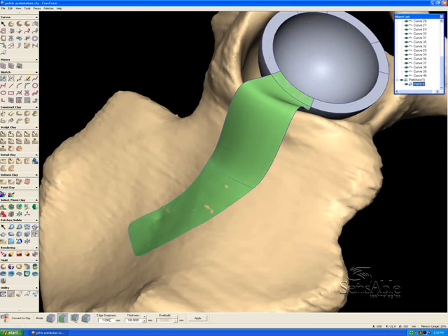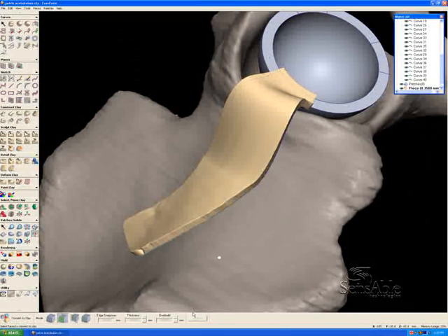And then I'm going to go down here and select an edge sharpness of 0.35 millimeters and a thickness of 5 millimeters. I don't know, actually let's make that 4 millimeters, and then we'll say OK. We'll apply that, and what that's going to do is create a thickened representation of this surface in virtual clay that then we can sculpt and model however we see fit. And you can see the representation here. What's happened to the patch, however, is it's disappeared and it's been replaced by a piece of clay.